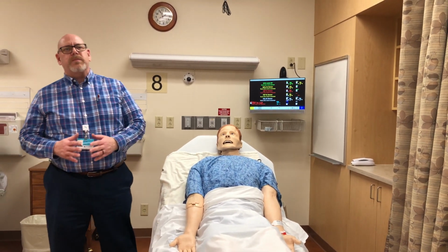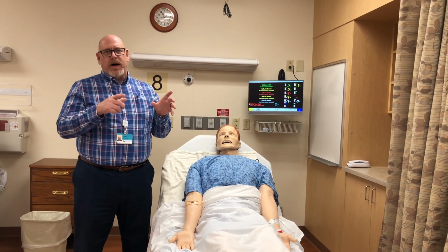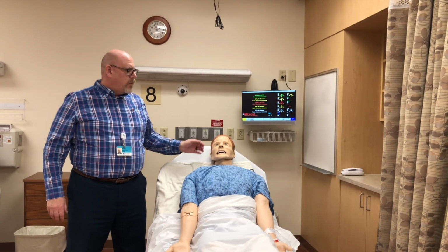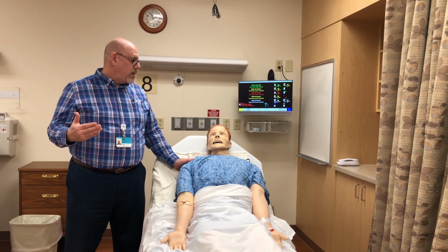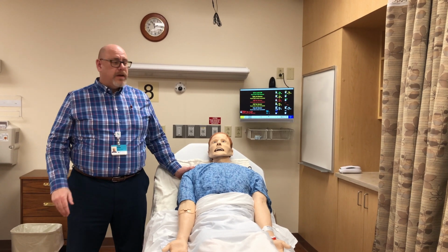And when we use these mannequins, we actually have our instructors sit in the back watching on a monitor, and they wear a gaming headset. So when you ask this patient a question, the instructor in the back can actually hear the question and respond appropriately with the appropriate answers that advance that scenario that you're working with today.